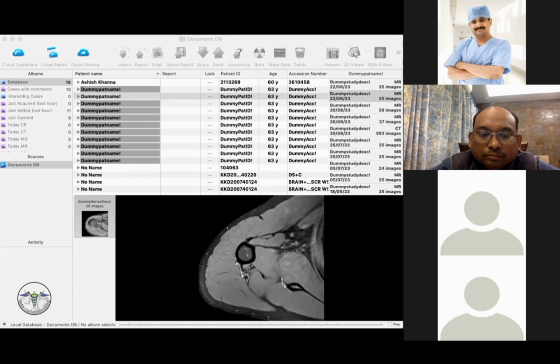That's what the Stryker notch view is for, taken with 90 degree abduction, and forward flexion to get the Hill-Sachs. But with all these modalities, you won't be operating by looking at X-rays only. Nowadays there is so much information available.